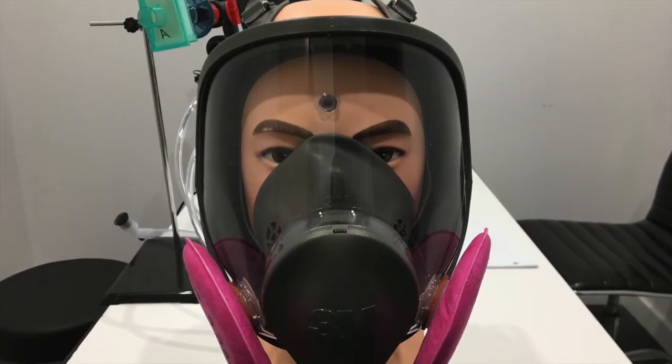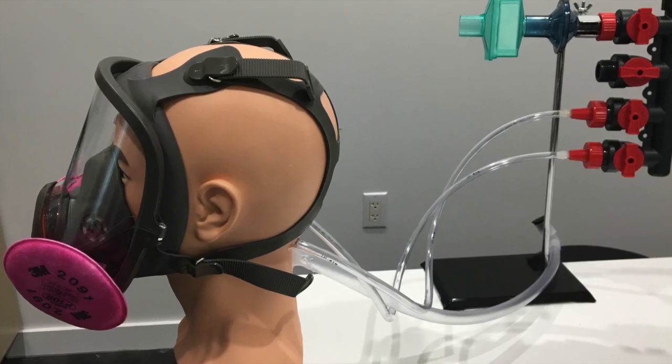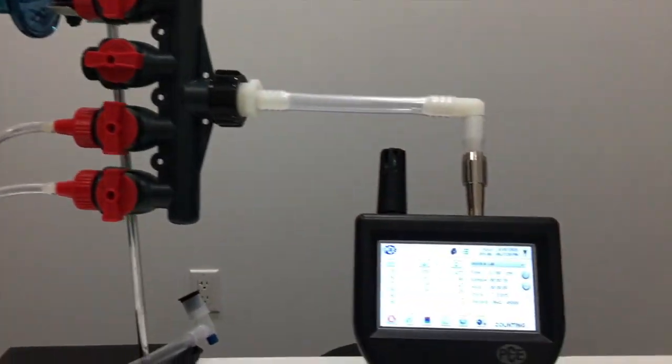Our next shot is the picture of the mask on the particle counter mannequin head, here's the view from the side. This is the 4-port manifold connected to the particle counter, and you can see that it's open to the air. In the next part of the video we're going to show the sampling of the air around the mask.